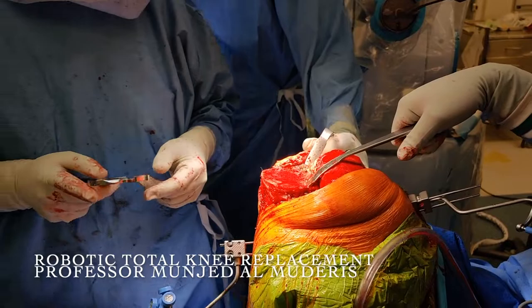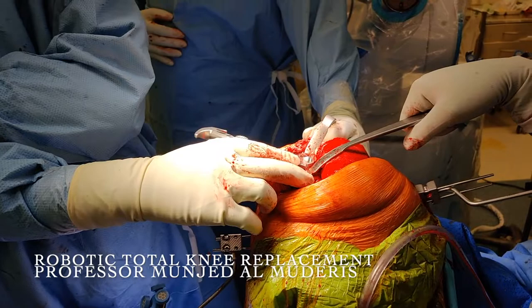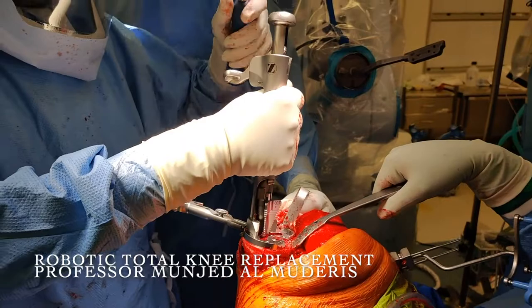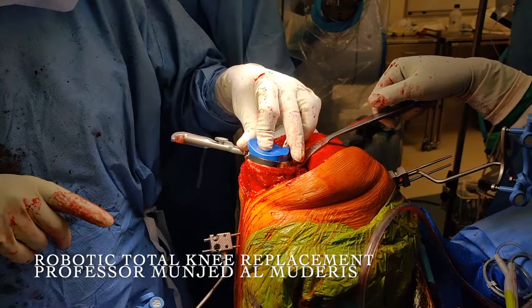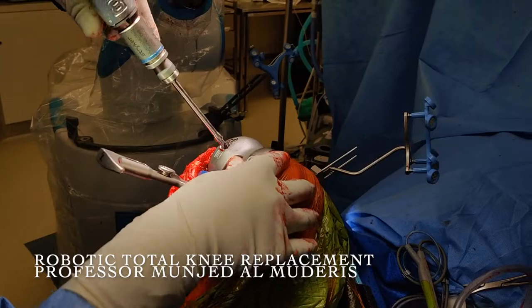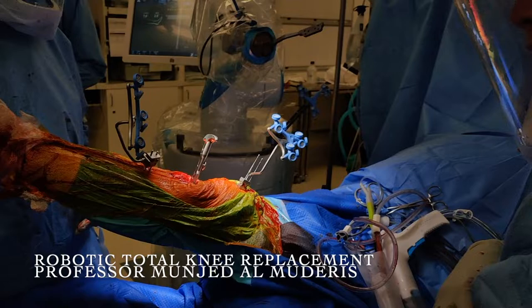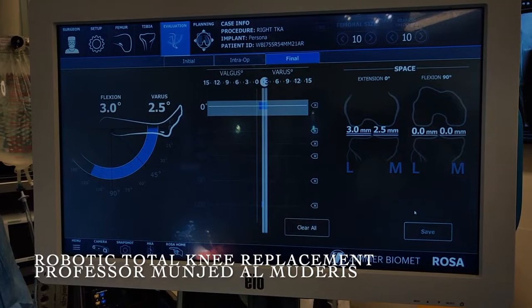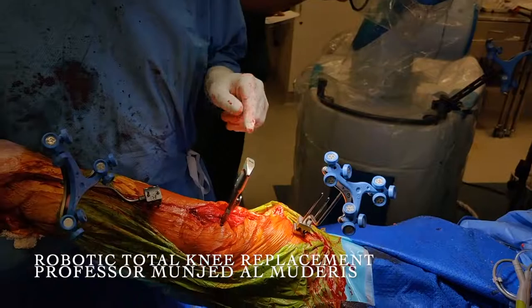We template a size G for the tibia, which seems to be the correct size. We skew the tibial trial in place using a screw. After broaching a keel hole, we place the trial spacer and position the trial femur — as planned, it is a size 10. We perform the lug drill holes and check the trial position. The computer confirms alignment has improved from 14 degrees varus to 2 degrees varus and from 13 degrees of flexion to 3 degrees of flexion. The knee is very well balanced and I am satisfied with range of movement, stability, and tracking.